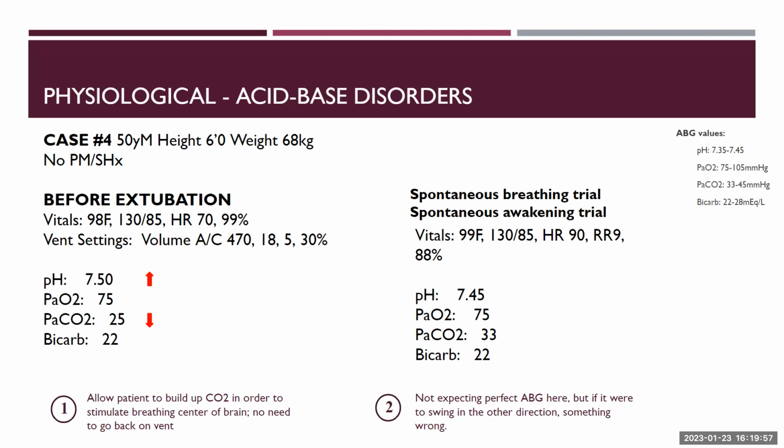Your institution might be at a lower level than you are, but going lower than what your institution says is probably a no. You don't want to go against your institutional guidelines.